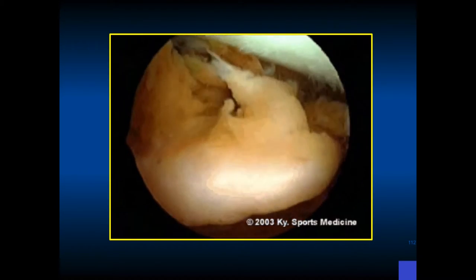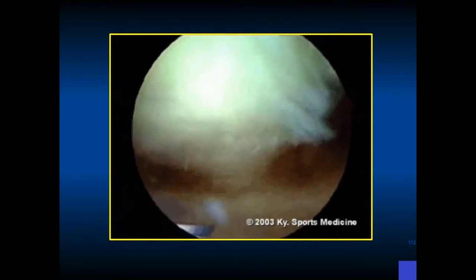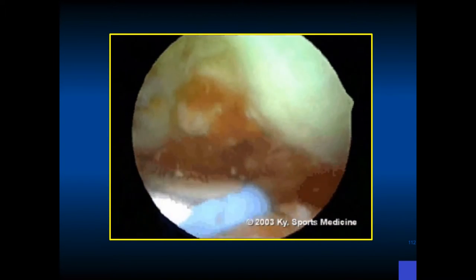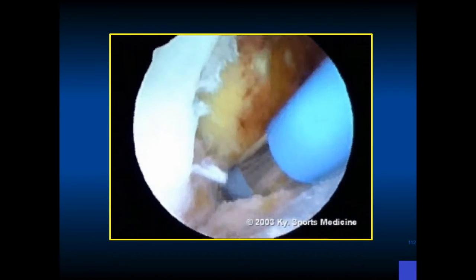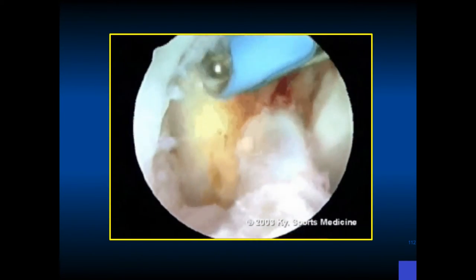I used a shaver and burner unit that was one unit so I could control the bleeding and minimize the number of passes going in and out of the knee. Anywhere there's synovium, basically the PVNS proliferates. Did end up using a drain on her. And then this is the burner electrocoag unit that you can use in addition to the shaving.